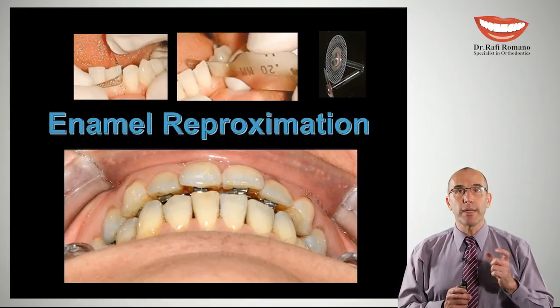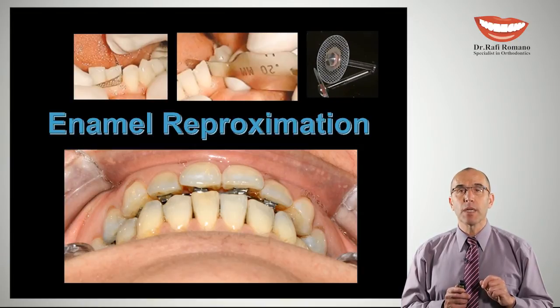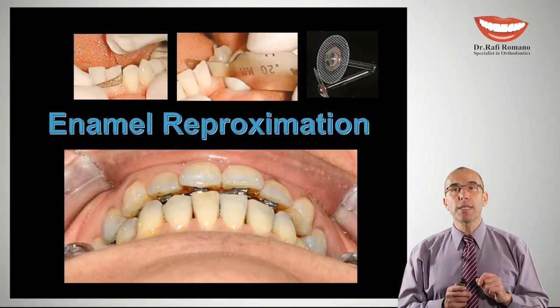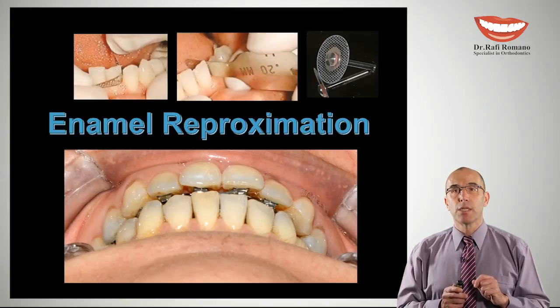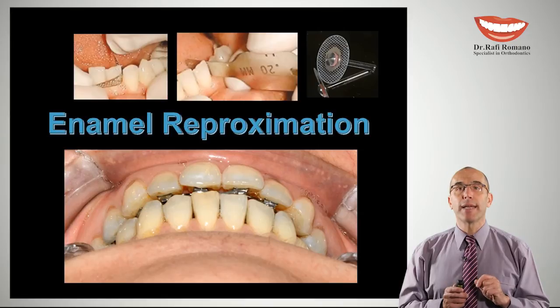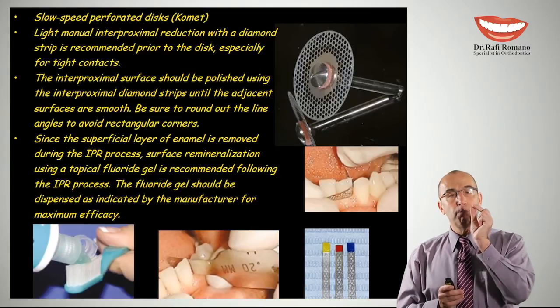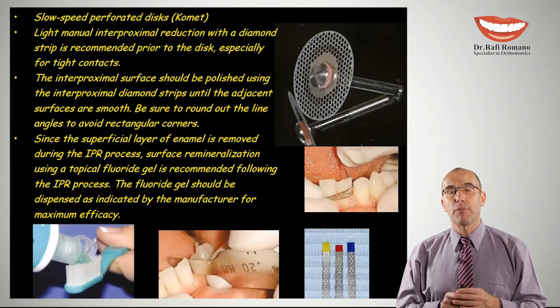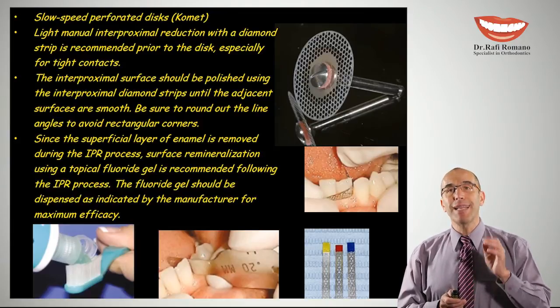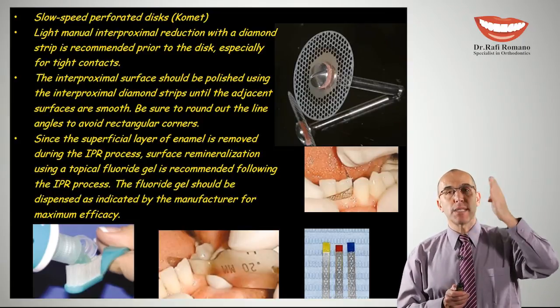So here she is at 28 weeks of treatment. Alignment is quite nice. Overjet is still big and needs to be improved. And that's about the time that we decided that we want to do the stripping. So we have taken the enamel reapproximation tools, and now with our measuring gauge, as exists for all orthodontics, I can plan exactly how much stripping I am doing for this specific case.